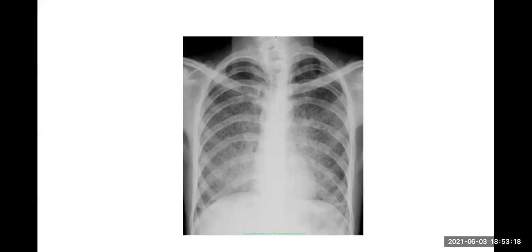Miliary mottling. This you see in tuberculosis and also sometimes in cancers, right? That is called miliary carcinomatosis. Some cancers can cause this appearance and that's called miliary carcinomatosis, right? So that is small nodules all over the place, all over the countryside.